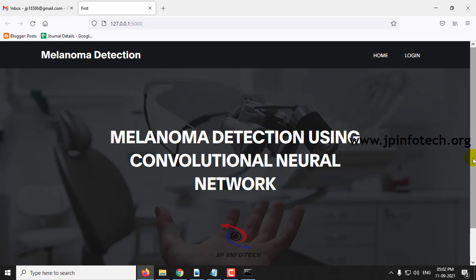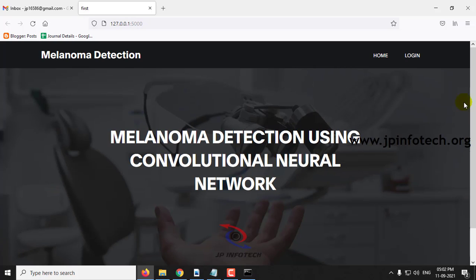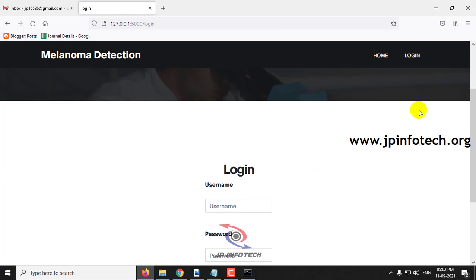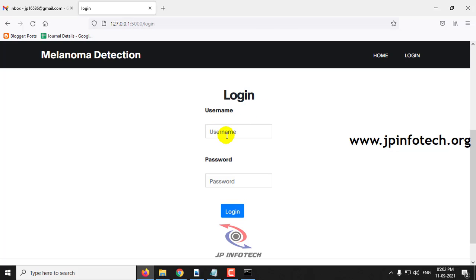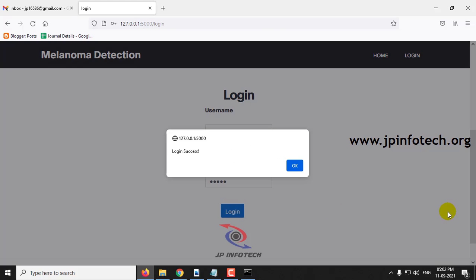Melanoma Detection Using Convolutional Neural Network. Click the login page — this is a static login page with the default username and password as admin and admin, because we have not used any database here. Enter this default username and password and then click the login button.